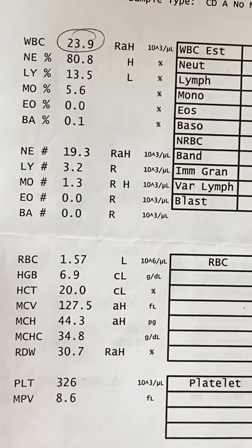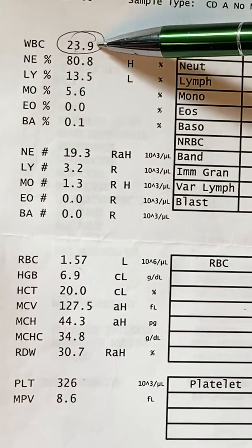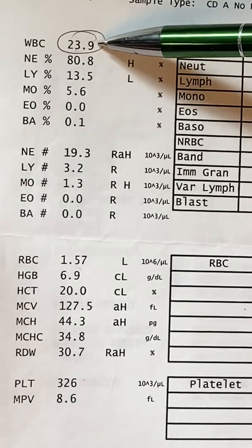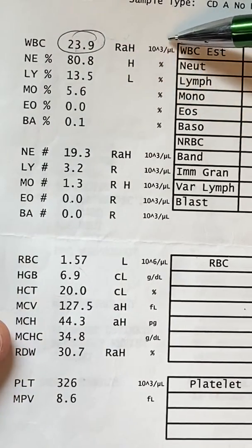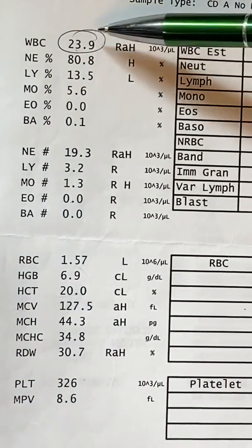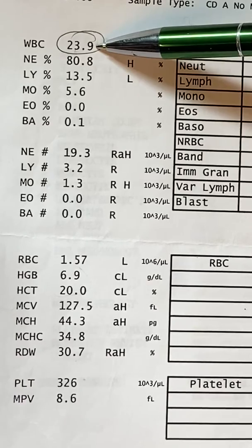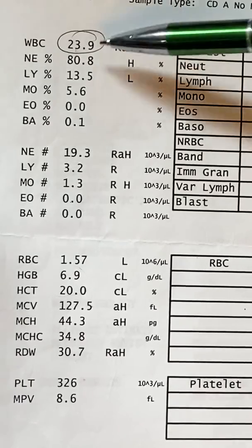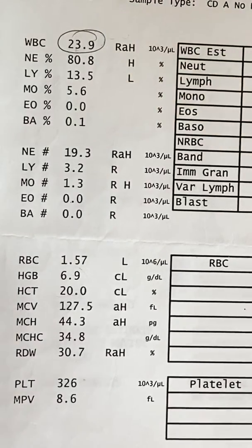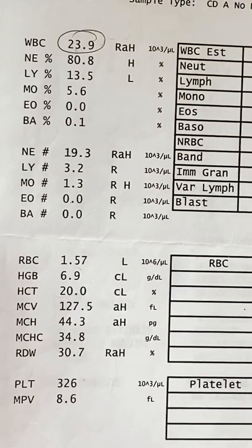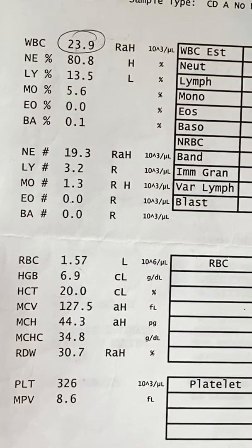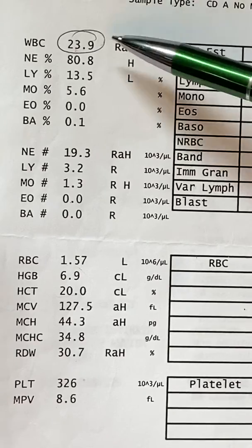And so the number that we see here, circled at 23.9 times 10 to the third per microliter, that value could be a little bit skewed because of the presence of so many NRBCs that are present. That's something to note here.